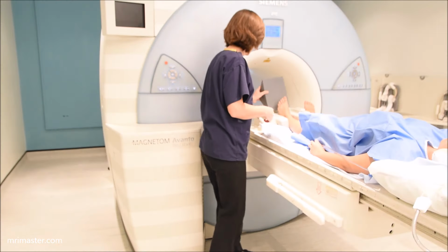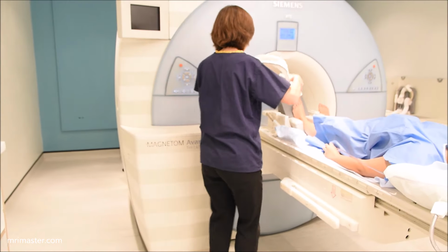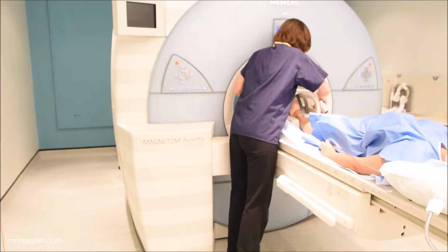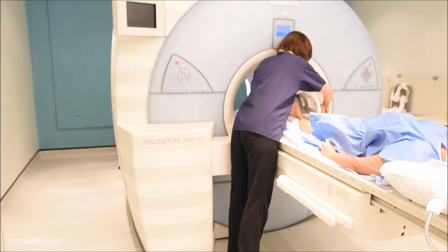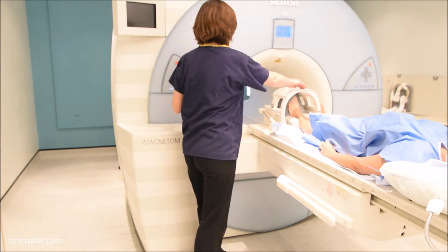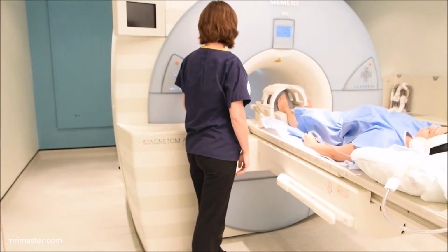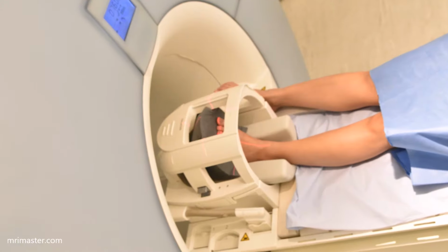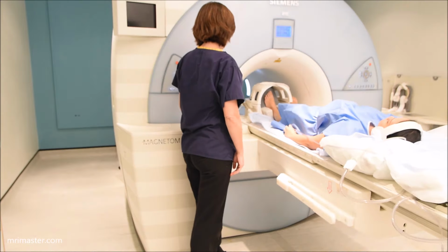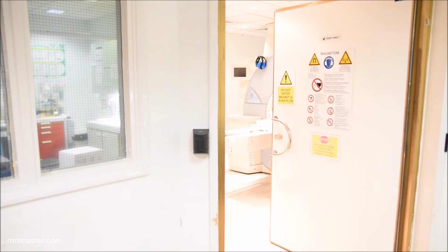and provide ear protection in accordance with the manufacturer's guidelines. Use some padding to immobilize the foot and to keep it flexed at an angle of 80 to 90 degrees. Add the anterior part of the head coil and plug it in. Move the patient into the scanner and center the laser beam localizer over the midline of the foot. Now slowly move the patient fully into the bore of the magnet, ensuring they're calm and comfortable before leaving the room.